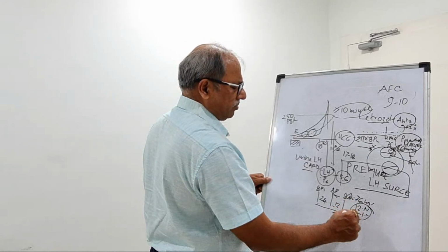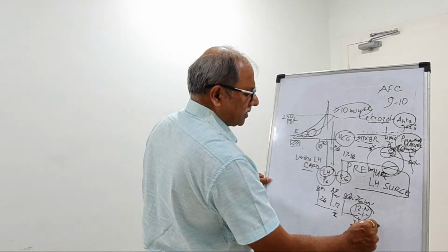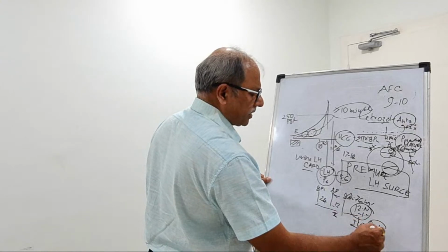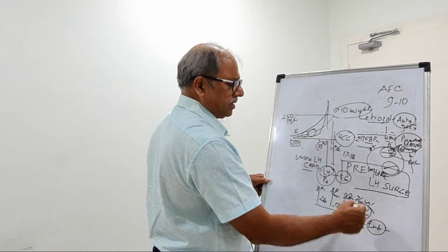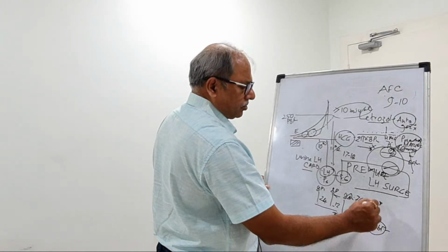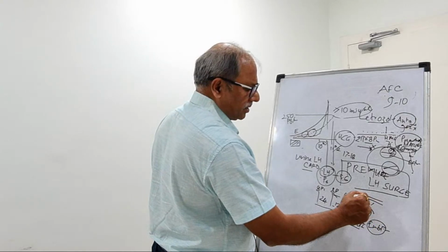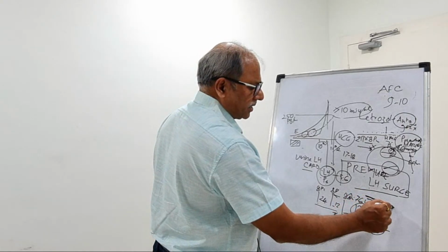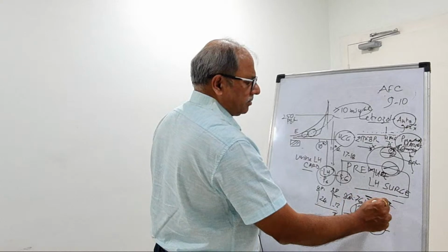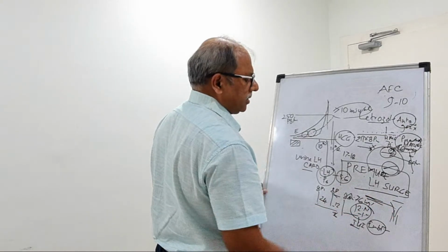And we did IUI with an embryo transfer catheter. Nowadays I use only the embryo transfer catheter because it is a little bit Indian make, a little bit cheaper. The technique of this catheter is that it contains a very soft internal catheter, and we release it without holding the uterus, just with the help of a Sims speculum.